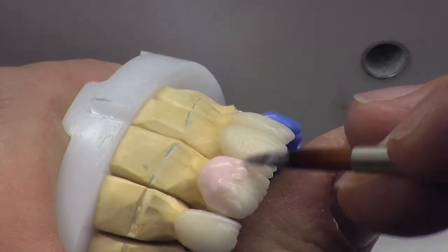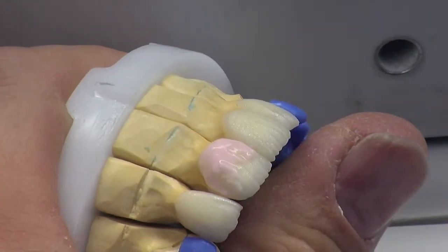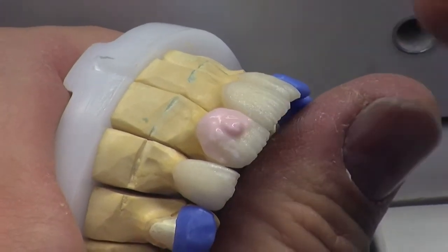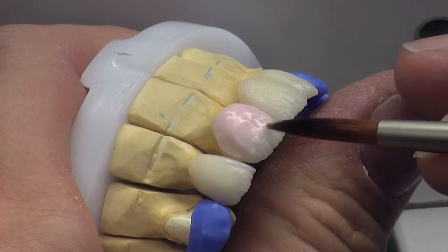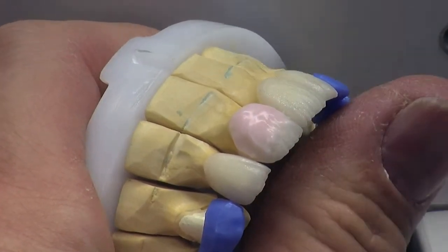All I'm doing now is layering on my basic two dentines, which I've mixed up as A1 and BL3, which make up the main body of my colour. It's a very simple way to produce a really good result, which is the great thing about the product.